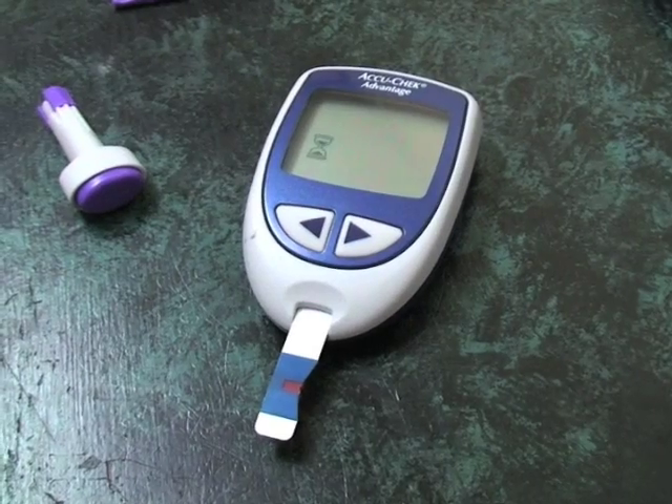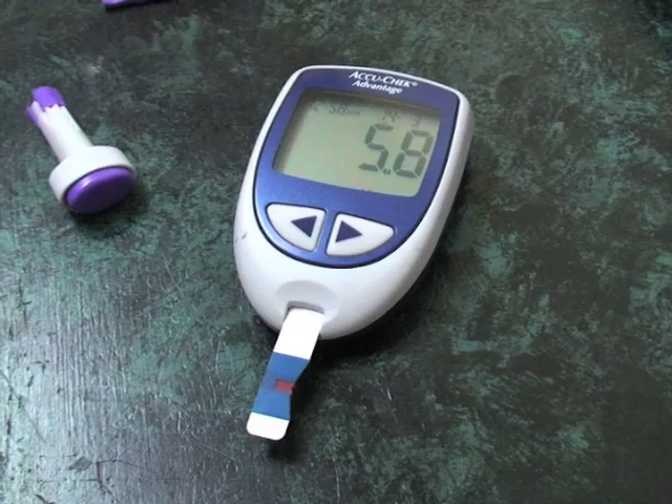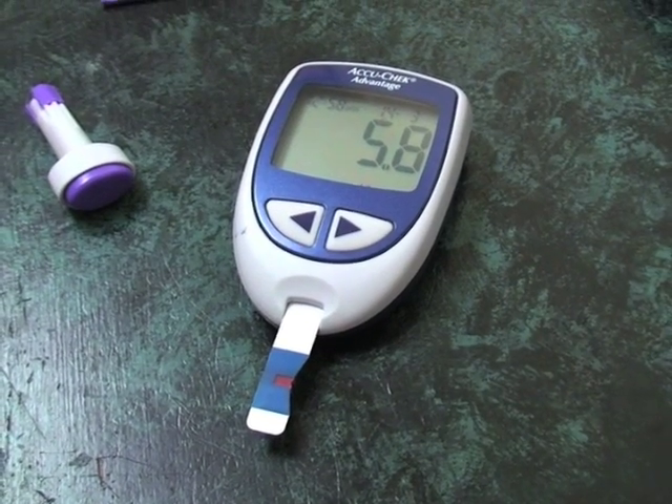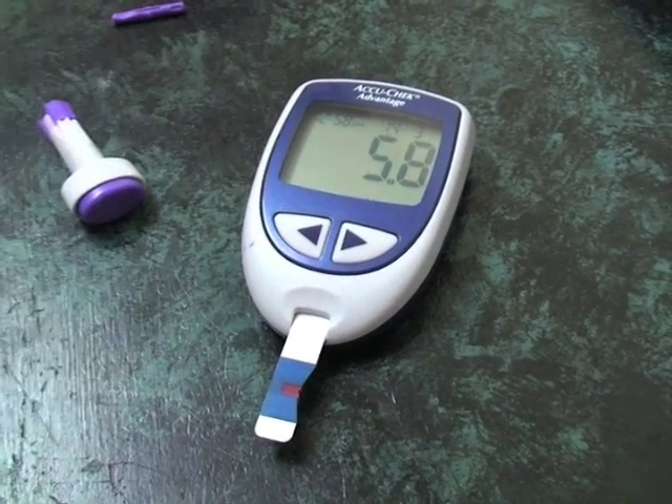I've just had lunch, so I'm not quite sure which way the blood sugar is going to go. There you go — 5.8, and in millimoles per liter, which is what we use in Australia, that's a normal reading.